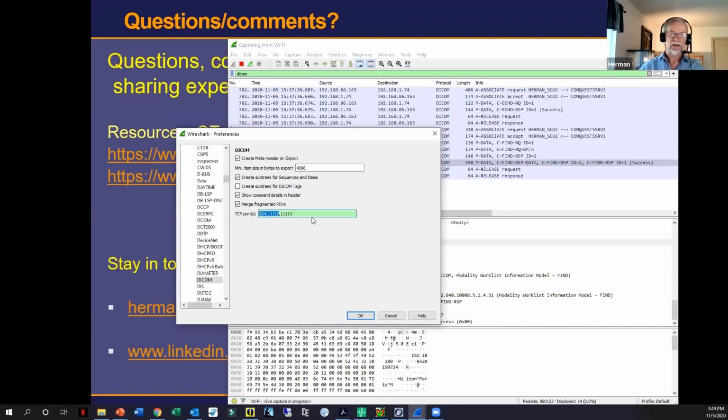Don't use 5, 6, 7, 8, 6001 or whatever, because, particularly with security, you want to have assigned port numbers to the devices that they belong to, so that you can monitor your ports and you can control the ports on your routers, because with the cybersecurity issues, it's a big deal.